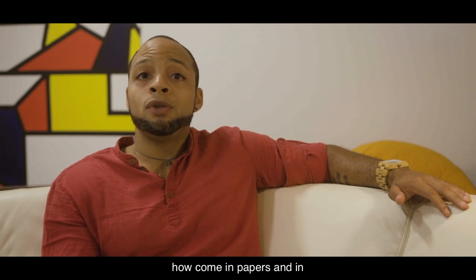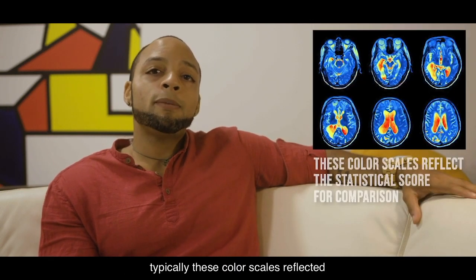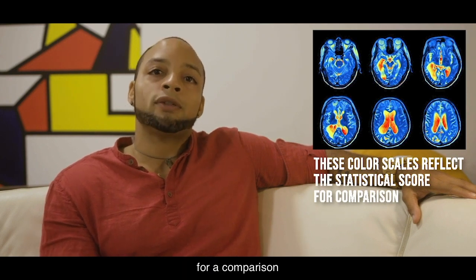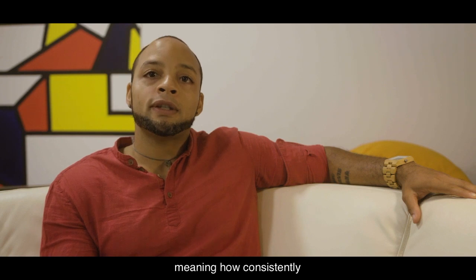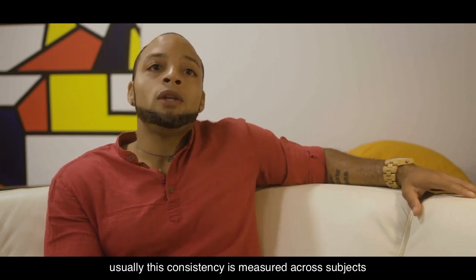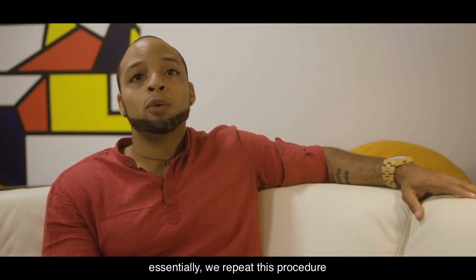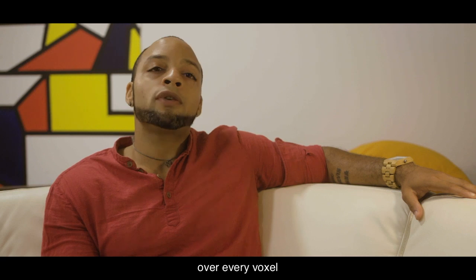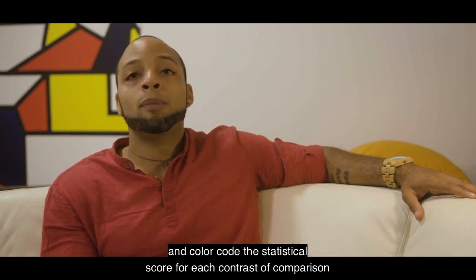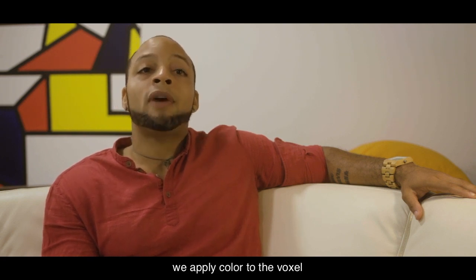How come in papers and news articles we see pretty pictures like these? Typically, these color scales reflect the statistical score for comparison, meaning how consistently one psychological condition gives bigger BOLD signal than the other. Usually, this consistency is measured across subjects. Essentially, we repeat this procedure over every voxel and color code the statistical score for each contrast of comparison. When this score is higher than the threshold, we apply color to the voxel.